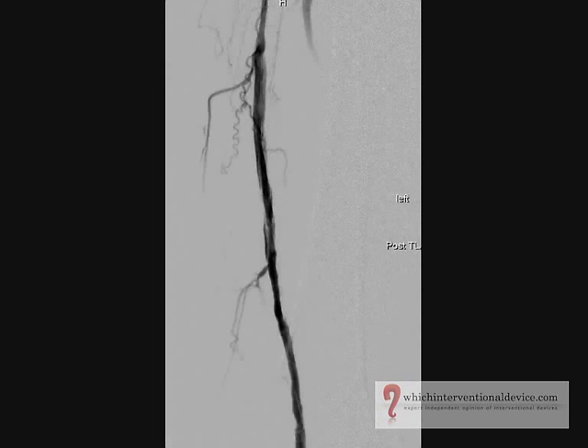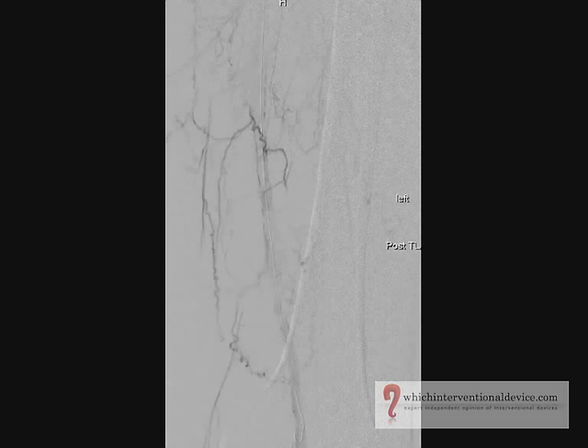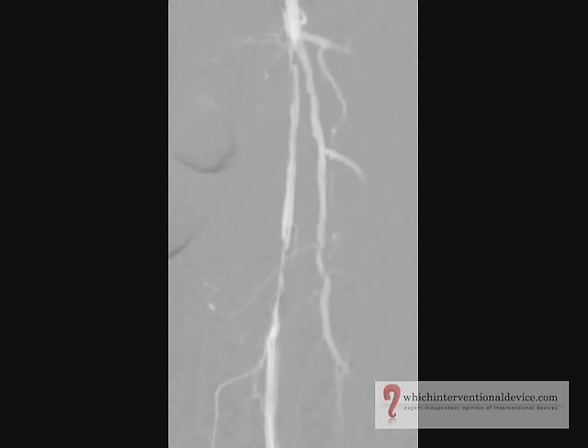The balloon is then deflated and the test injection confirms good flow and the lumen is now patent. Two more proximal stenoses are then dilated using the same 6mm 4 French balloon.